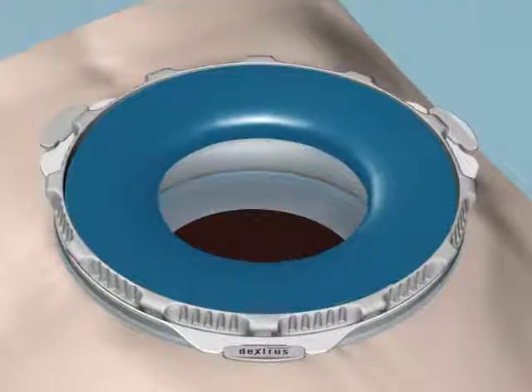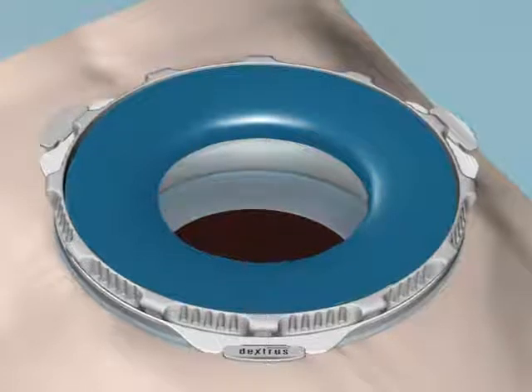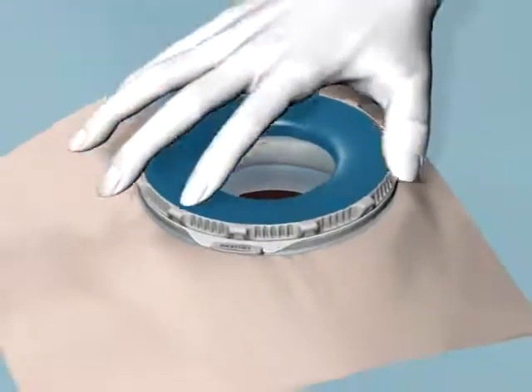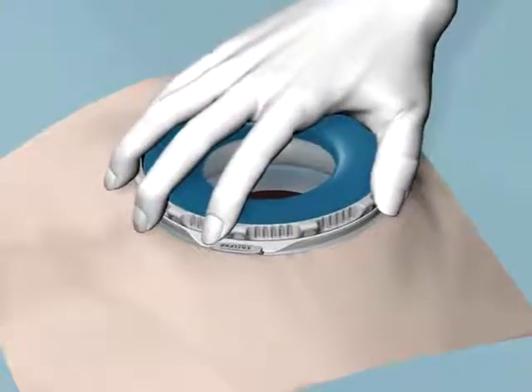Audible and tactile response will occur. To confirm connection of all three tabs, pull up on the seal cap assembly.